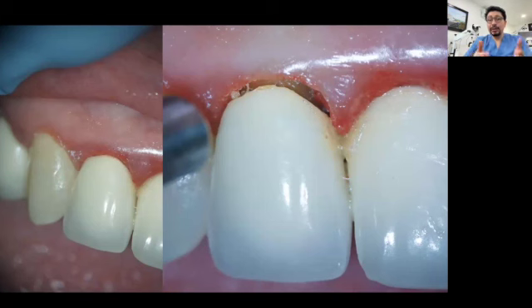And then you just need to send the pictures to the referral doctor, explain to the referral doctor what is happening, that the root canal treatment is not necessary, and that's it. The referral doctor will deal with that problem. And you didn't even have to tell the patient anything bad about the referral doctor. So it's a very easy way to have good communication with the referral doctors as well.